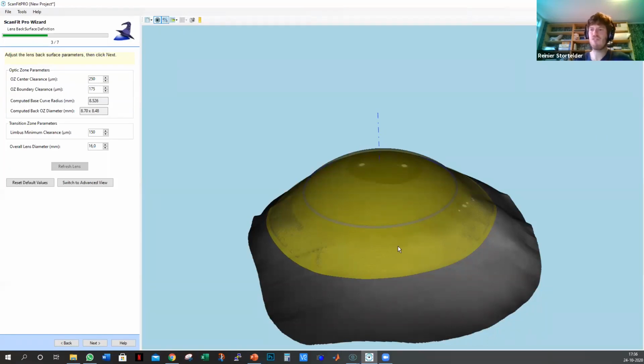And they go for this final lens, and they're not pointing to a trial kit anymore because they don't have it, because they're just customizing the lens completely. So it's just the approach of the lab, how they do it. If they believe there should be a lens on the eye, or you can go completely empiric. And then probably, Tom, you can kick in as well. It's also dependent on your patients.